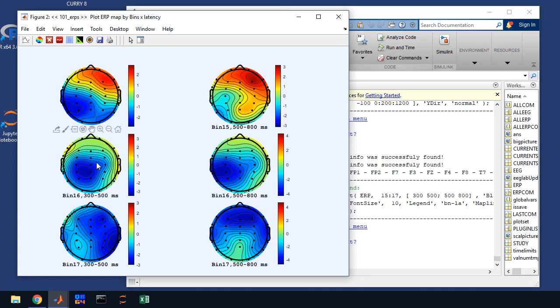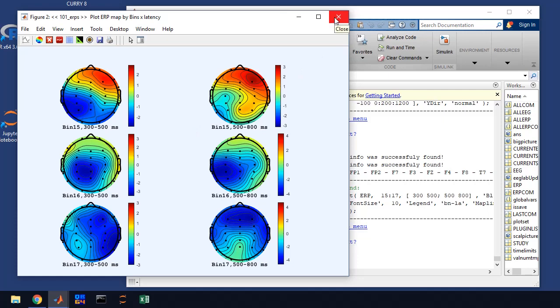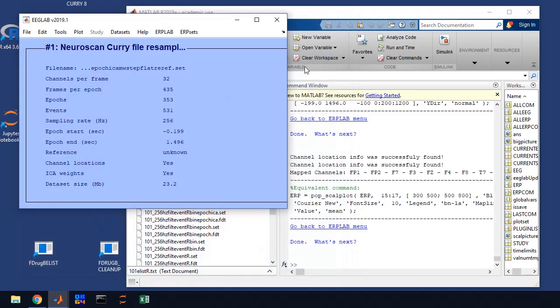And the other thing we want to look for is, does it look like the FN400? Does it look like the LPC? But we don't know what we're supposed to see in this particular study. So you don't really panic for that. You're just trying to look for anything that looks like it might be artifact or what the pattern looks like overall. So that's how we're going to plot those. And that's basically it. You have some other cleanup aspects. Just follow your protocol.